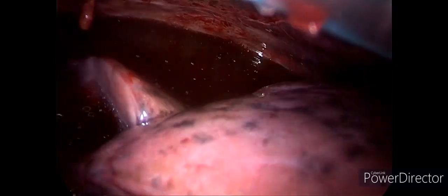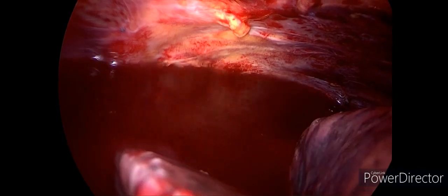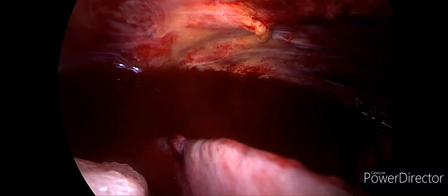You don't want to apply hard pressure on the lung. You may compress an air leak. So gentle pressure under the lung underwater and just checking for these major air leaks. Minor air leaks are negligible otherwise. And as we're inflating the lung, we're not seeing any major leak. Now we're looking for the lung to fully expand after the multiple resections.